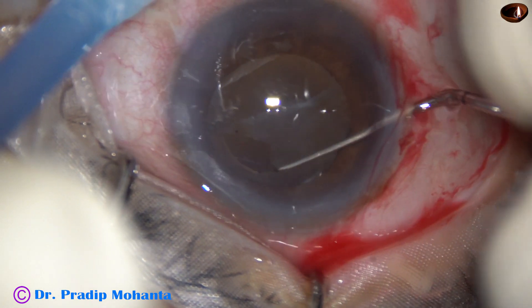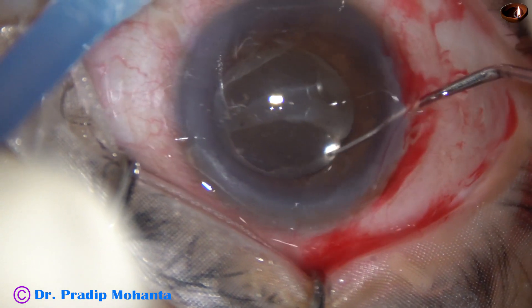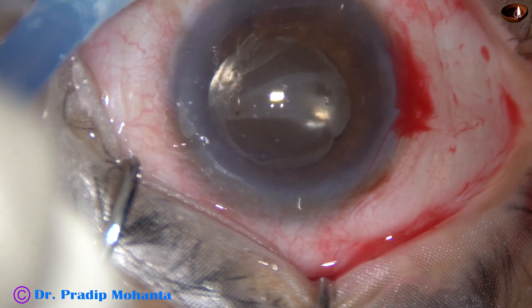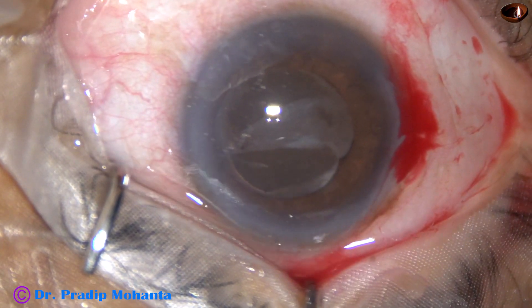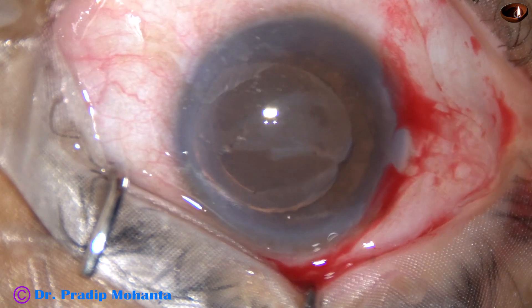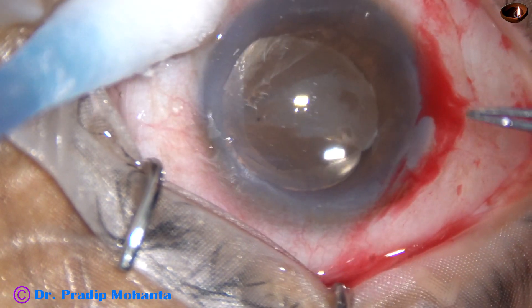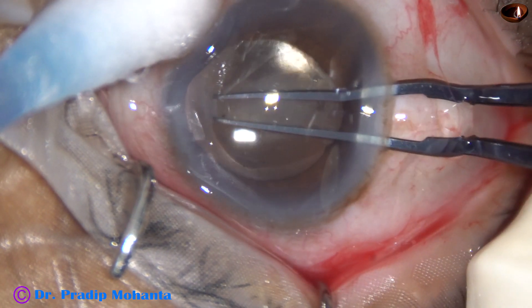Now I take a Utrata forceps to remove the membrane. Before introducing the Utrata, some more VSCO is injected into the anterior chamber. This is the Utrata forceps.